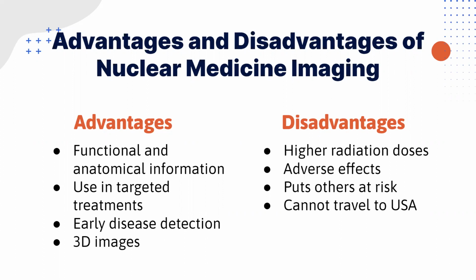On the other hand, the disadvantages are that it has higher radiation doses than common imaging like X-rays. Along with using higher radiation, some nuclear medicine procedures are longer and end up using even more radiation than others. This could cause skin reddening and hair loss. A client may also give off small amounts of radiation right after the procedure and need to take steps to protect others from exposure. Clients cannot travel into the USA while they are radioactive.